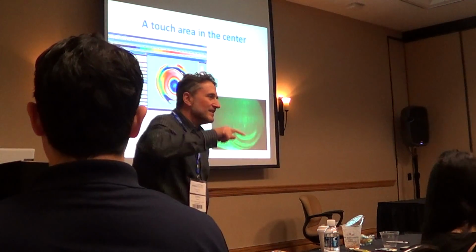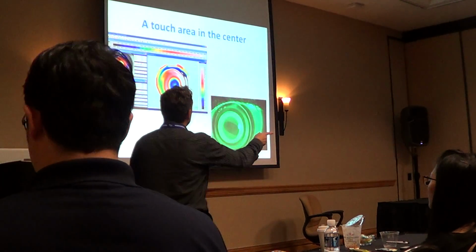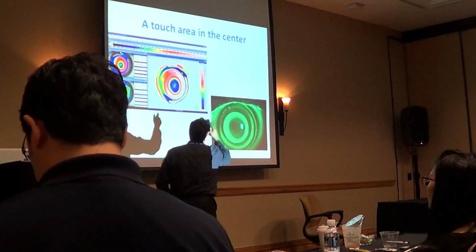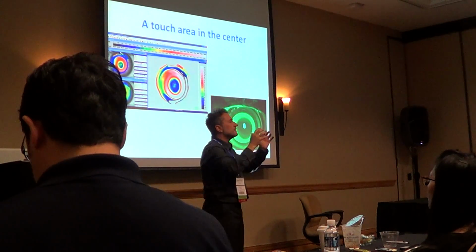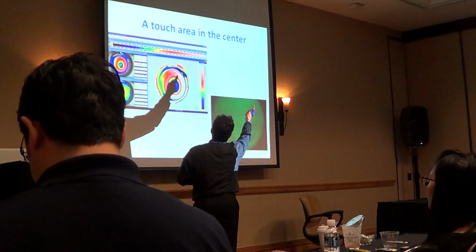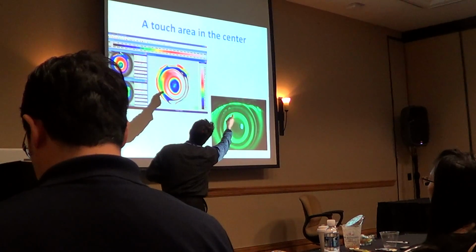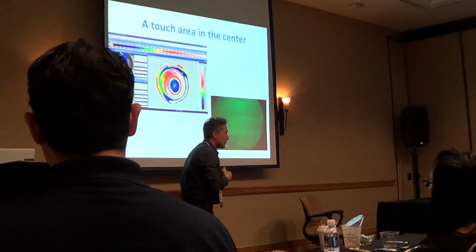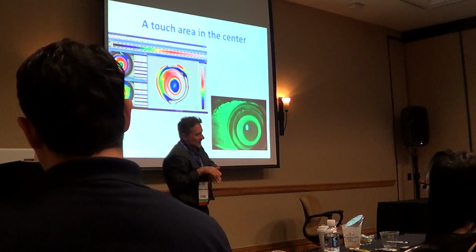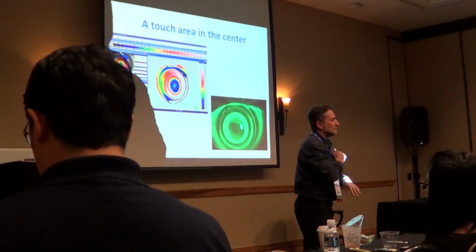When you have the croissant, you have pressure on one side and no pressure on the other side. You have a red ring here, but not here. This is the inner ring, and this is the outer ring. Remember, two red rings that couple together at the end. So the inner red ring is this one, and the outer starts here and will arrive like this. But it doesn't, because there is no pressure. Why is there no pressure? Because the lens is tilting, arriving at the limbal area and jumping over the corners. No pressure at the end of the reverse curve.